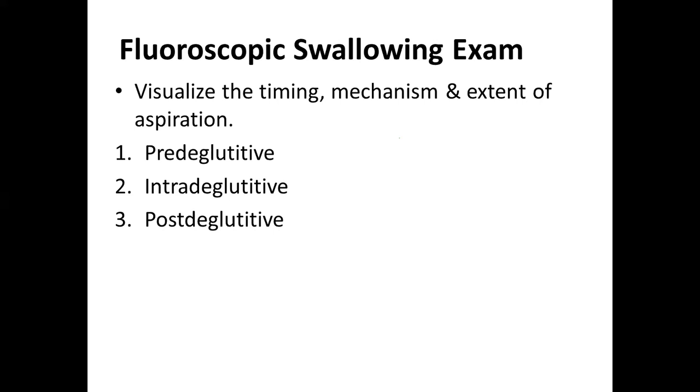This one is commonly seen when the patient has a stricture. The stricture, or a mass pressing on the esophagus, makes the contrast lodge at that level, and the contrast usually goes back. When the contrast comes back, it finds the epiglottis, which covers the larynx, has moved back to its position, increasing the chances of contrast going into the larynx, leading to aspiration.